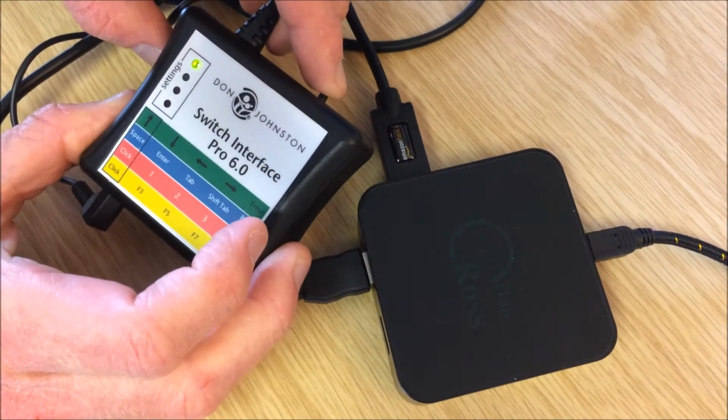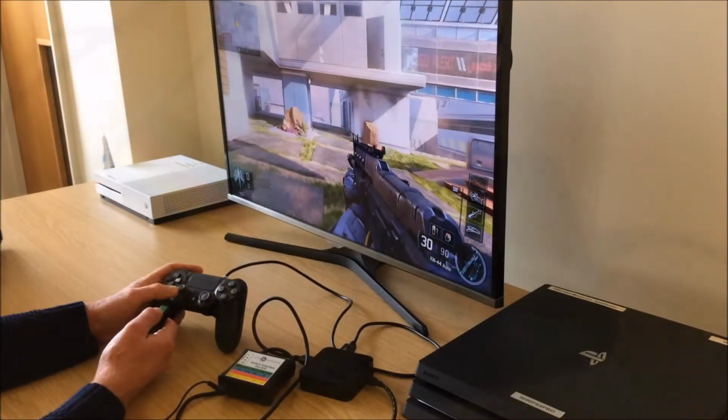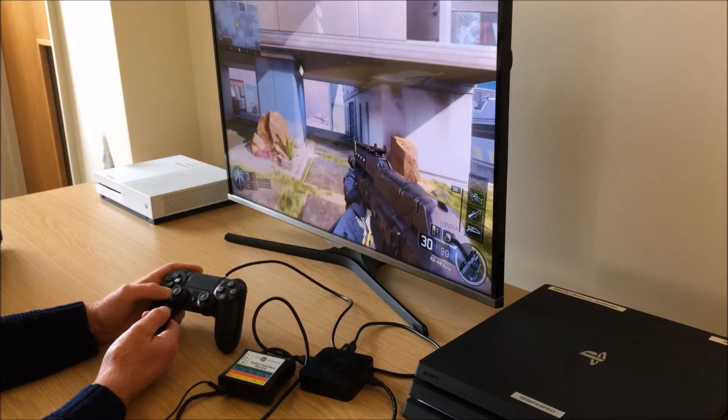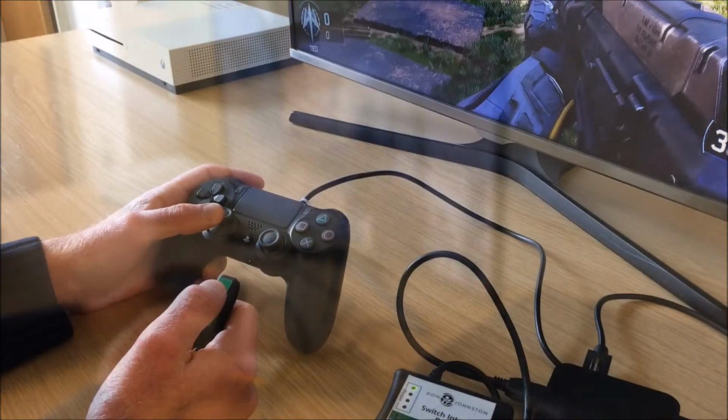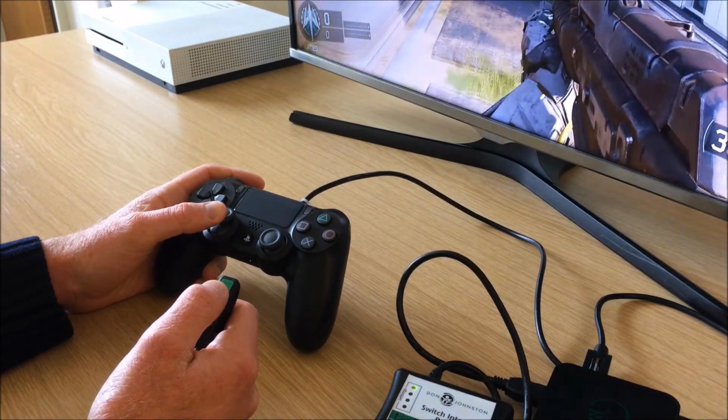To set up the walk forwards button, press the button on top of the Don Johnston until the LED light moves to the top. Here we will show how the walk forwards button will do the same thing as pushing up on the left analog stick, which will make you walk forwards in game.